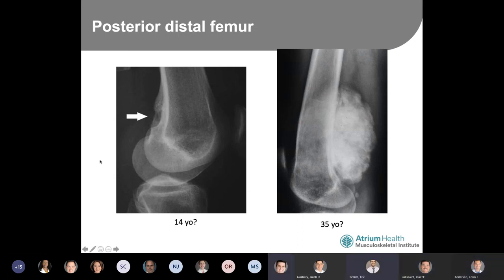What was it? Cortical desmoid. Oh, nice. Also known as a tug lesion. It's a lesion that forms at generally the insertion of the medial gastroc, and oftentimes on tests you'll be given axial imaging, such as an MRI, that will show a focal lesion back there. But you're correct, Alex, that this does have benign features.